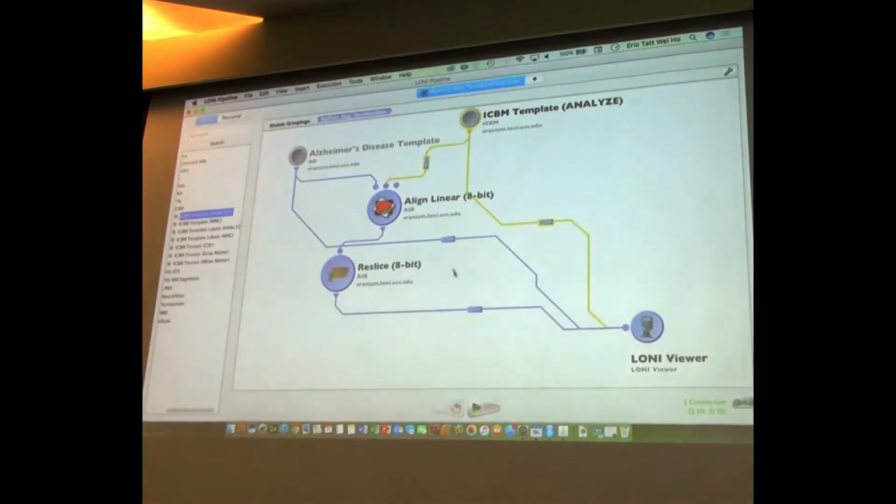All right. So now remember, how many operations do I have here? Let me see, 1, 2, 3 times 10. I've got 30 operations that need to be done. The 30 operations represent the 10 input volumes in here. In step 1, they're going to be converted prior to being fed into the registration module. So 10 conversion steps. 10 steps over here for aligning, spatially deriving the displacement vector field for each of these.